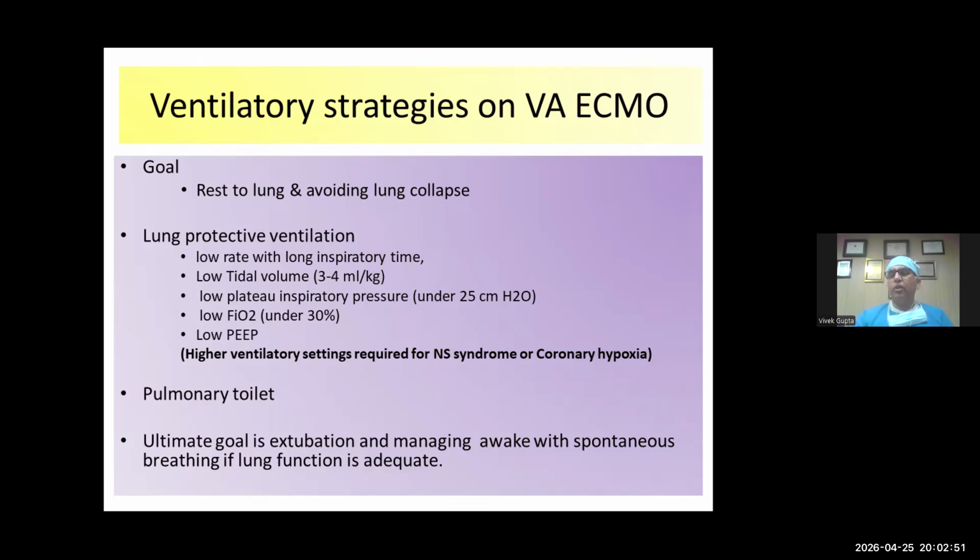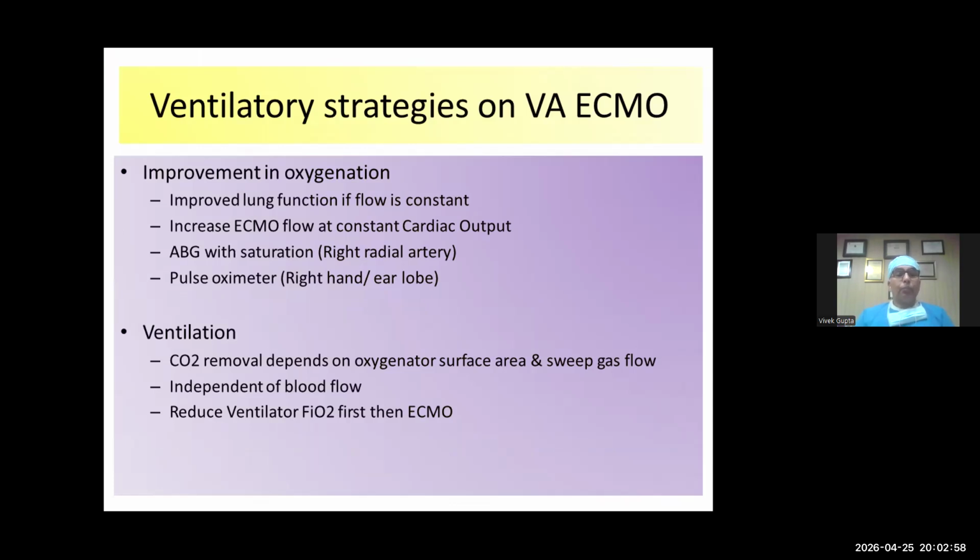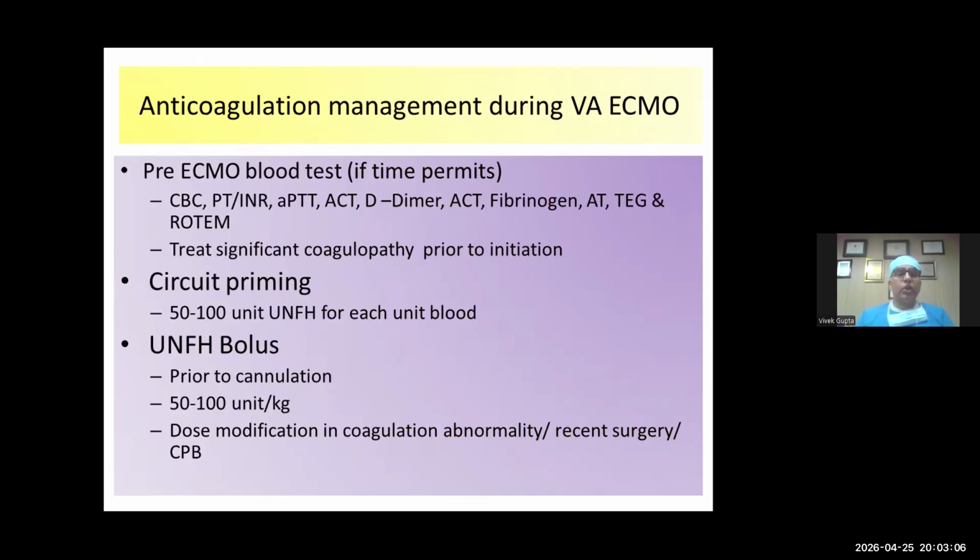Or sometimes, if the patient is otherwise fine, you might extubate your patient. The ultimate goal is extubation. So once the oxygenation is improved and blood gases are showing a good saturation, we can extubate these patients.